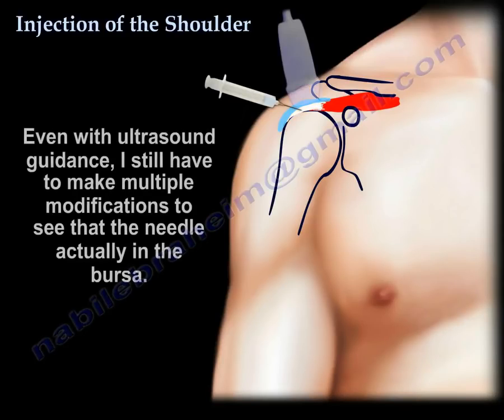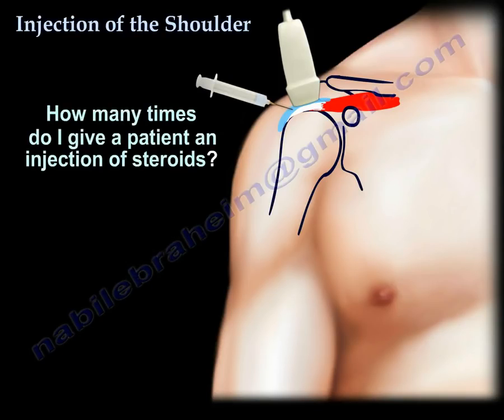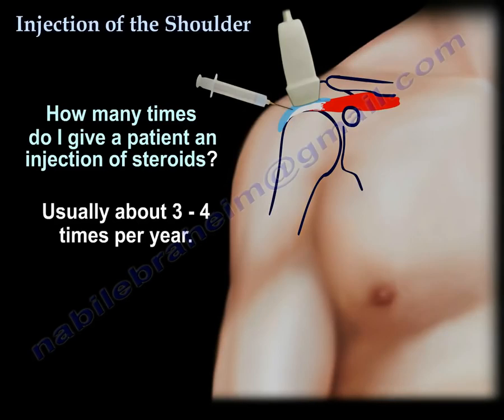Even with ultrasound, I have to make multiple modifications to make sure that the needle is in the bursa. How many times do I inject the patient? About 3 to 4 times a year.